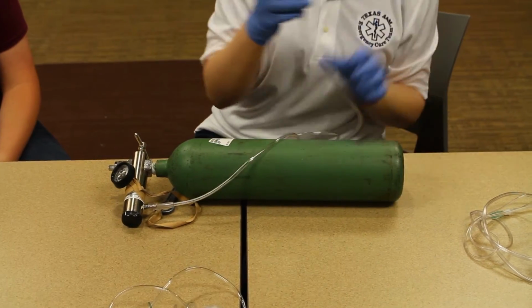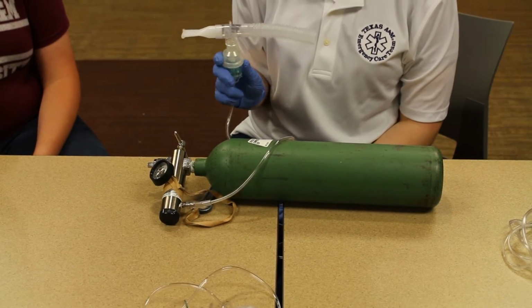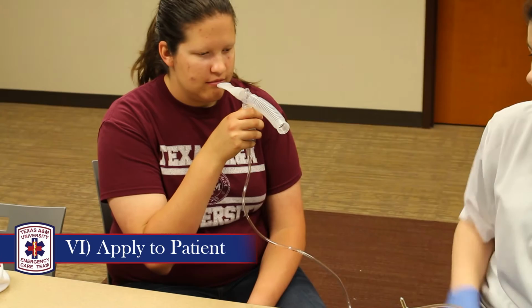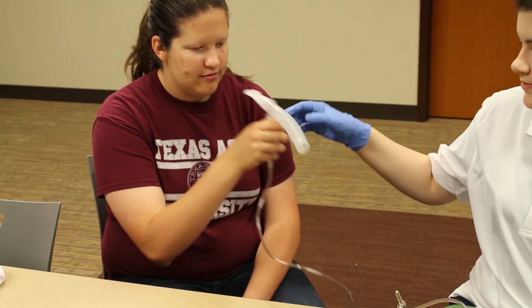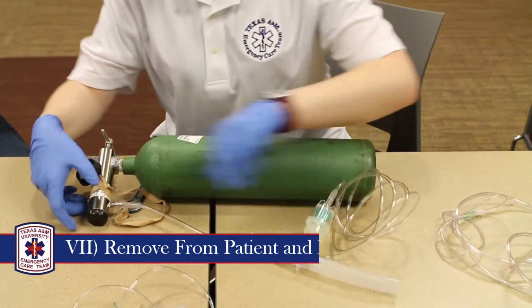Make sure you see a mist flowing from two ends of the nebulizer. Administer the device to the patient, making sure that you are not blocking the other end of the nebulizer. Remove from the patient and detach the tubing.